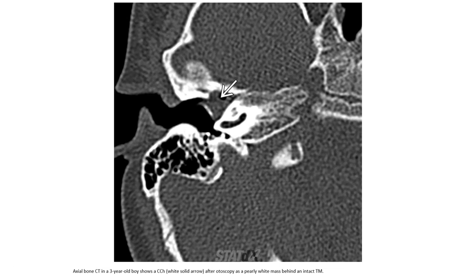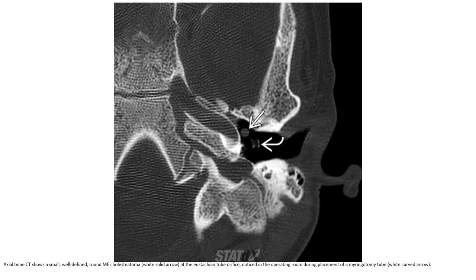Case 2: Axial CT of a 3-year-old boy shows the congenital cholesteatoma appearing as a pearly white mass behind an intact tympanic membrane on otoscopy. Axial CT shows a small, well-defined round middle ear cholesteatoma noticed in the operating room during placement of tympanostomy tubes.